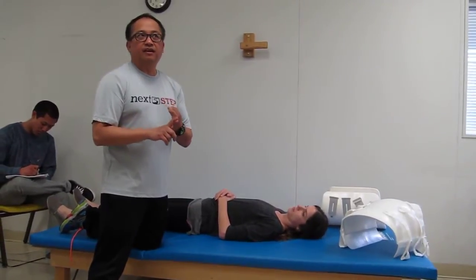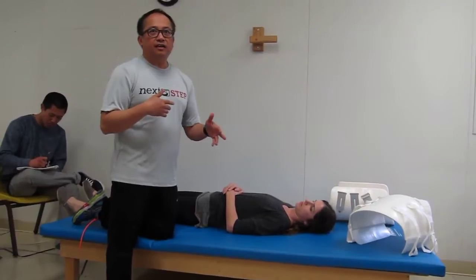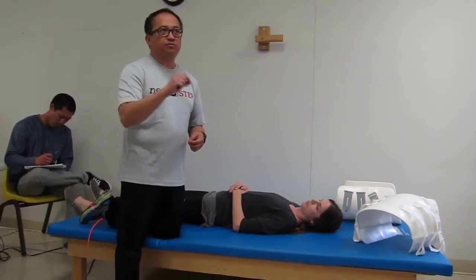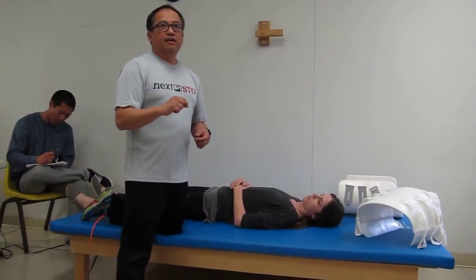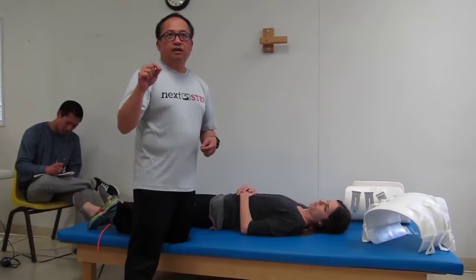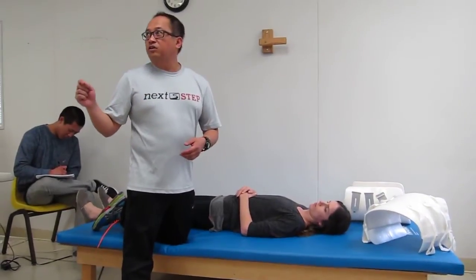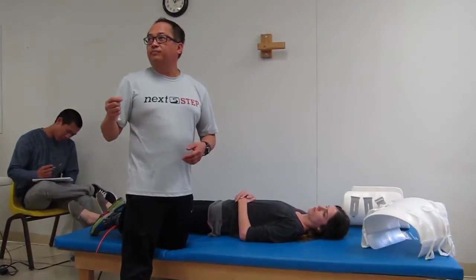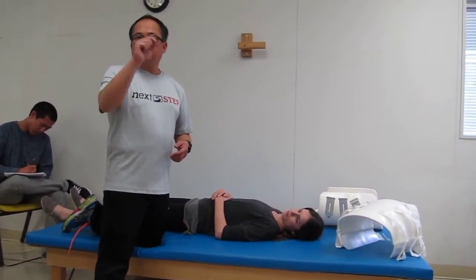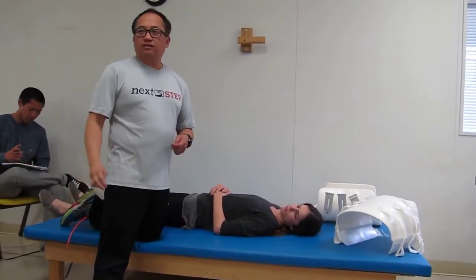Okay? And then once that's clarified, you make sure that it's in the MD orders. You can write that you spoke to the doctor: patient to don TLSO in supine, or patient to don TLSO seated at the edge of the bed, and then you would put your designation and then put verbal order from whatever MD that was.